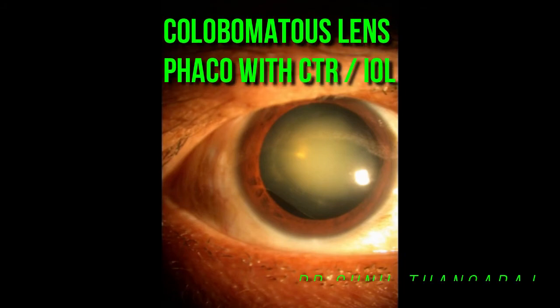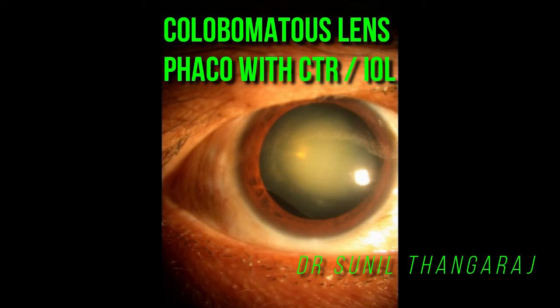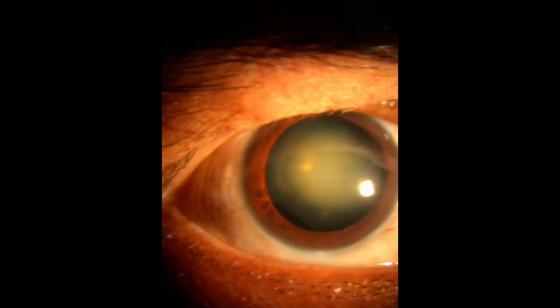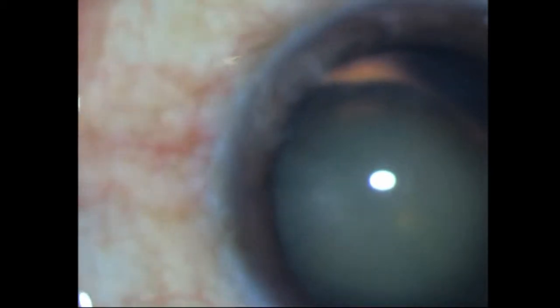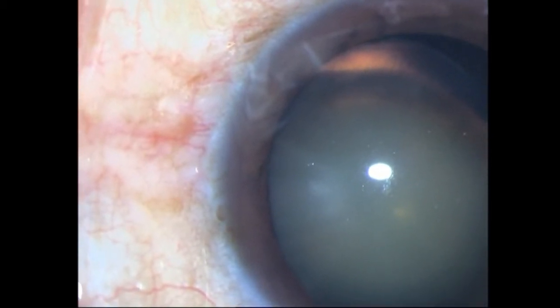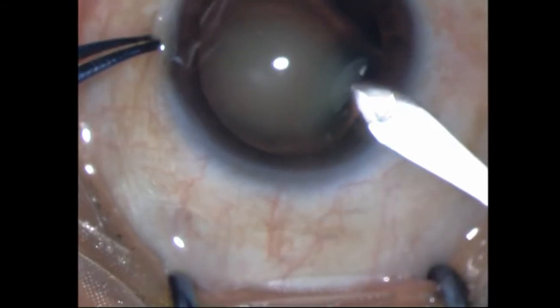This is a young 36-year-old lady who presented in my OPD seven years ago with an inferior colobomatous area of the lens with a significant cataract. Since the cataract was significant, we decided to go ahead and do a phaco. I am starting off with my 2.2 millimeter incision and the side port incisions as well.